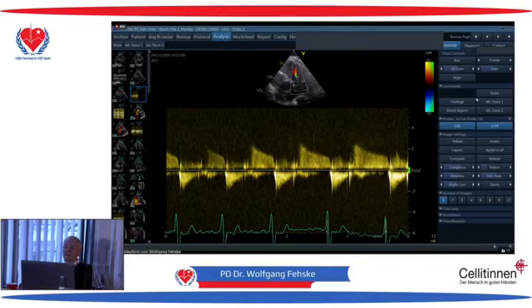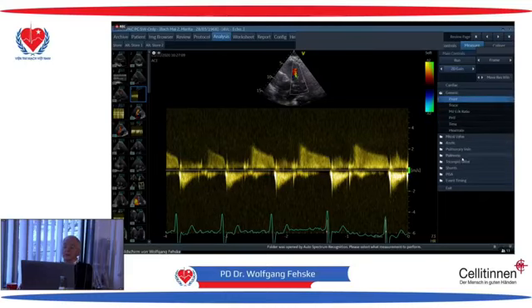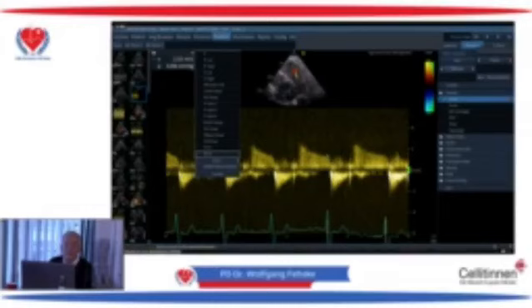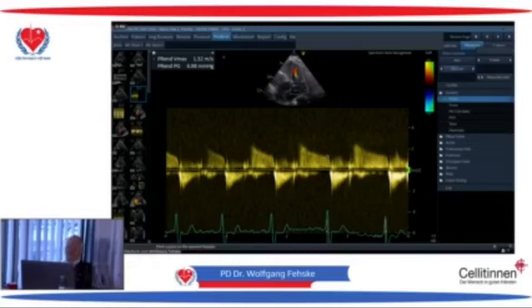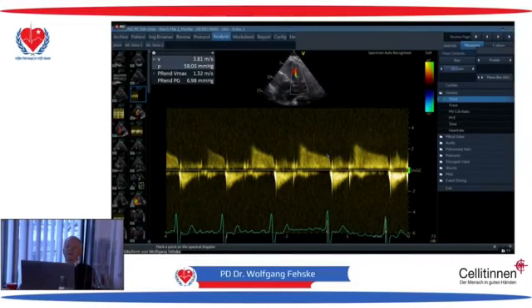And now today, I hope we can also define the pulmonary end diastolic pressure. Still interesting, we must be very careful. It is difficult to calculate the pulmonary resistance in these patients by right heart catheterization, but we have done it nevertheless. So what is the next question?